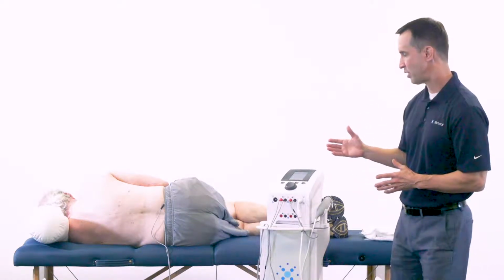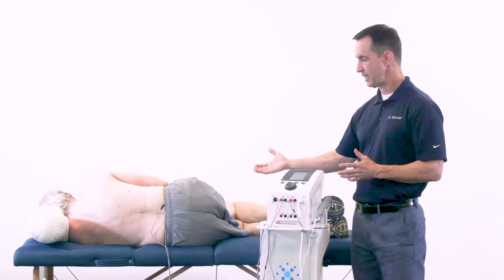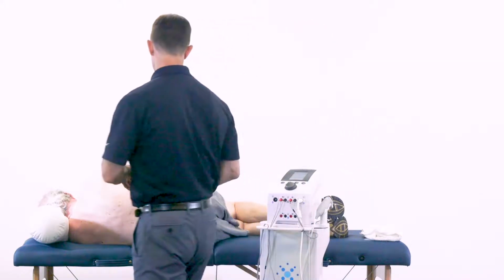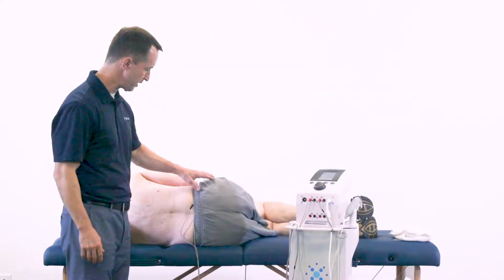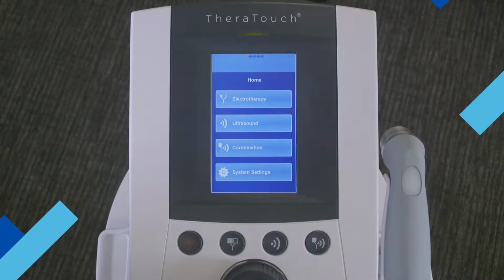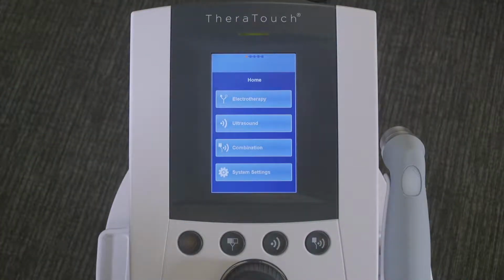And as you can see, we want to put the patient into a side-lying position and create the opportunity to do the exercise. I want to point out very quickly, we have the electrodes already in place. We've got the one electrode here and one electrode here. This is how you set up the protocol for this treatment approach.